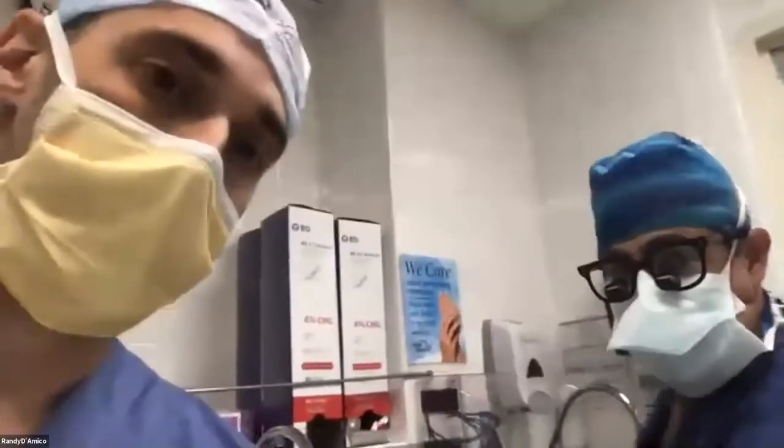The goal here is to resect as much as possible. If you get a total resection, the patient's cured. But even with a majority resection, there are treatment options, things like radiation, that can control the spread. Ultimately, the goal is to have this person on the operating table one time and hopefully cure him for life. You want to add anything, Dr.